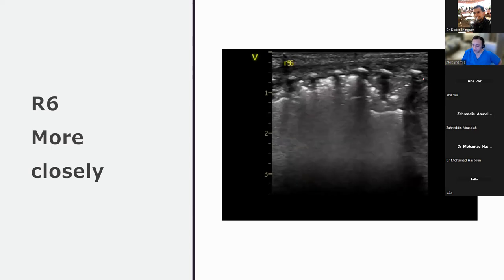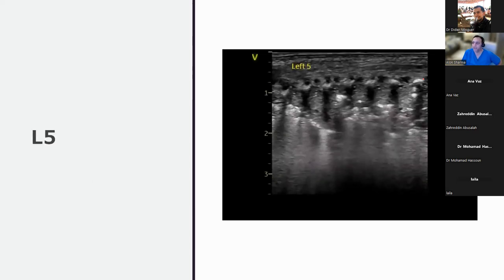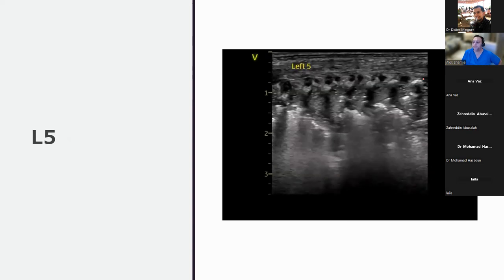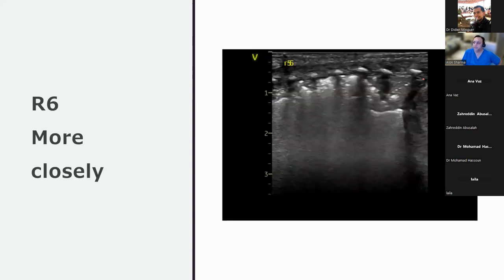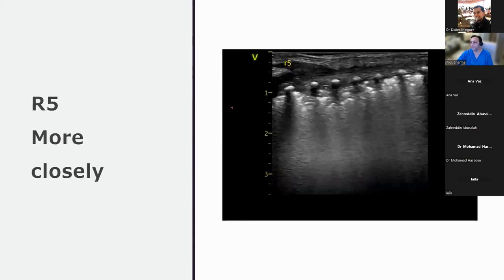So I'd just be a little bit cautious. You need to think of why that atelectasis is taking place. Excuse me, Alok. Yes, please. On R5, was there an element of effusion on the top left side of the screen? On R5? Here? No, R5. On back, I think the previous one. Here, on the top left-hand side. I would agree. Small rim there. Yeah, so I would agree. Yep.